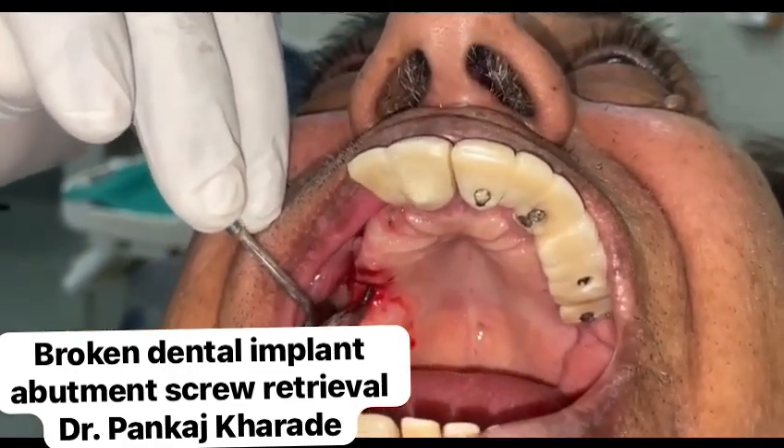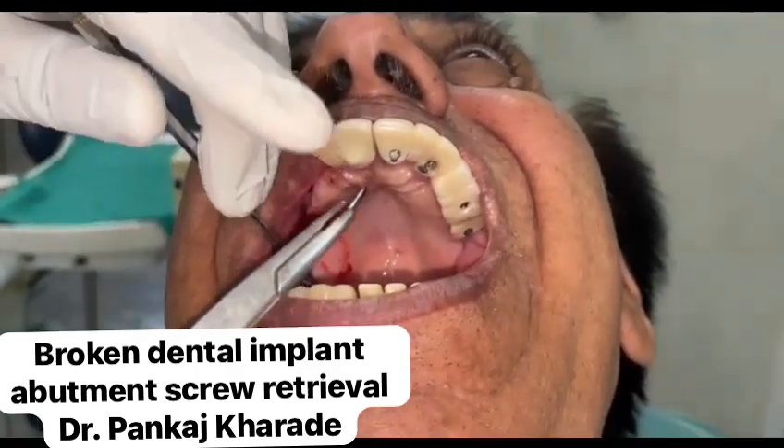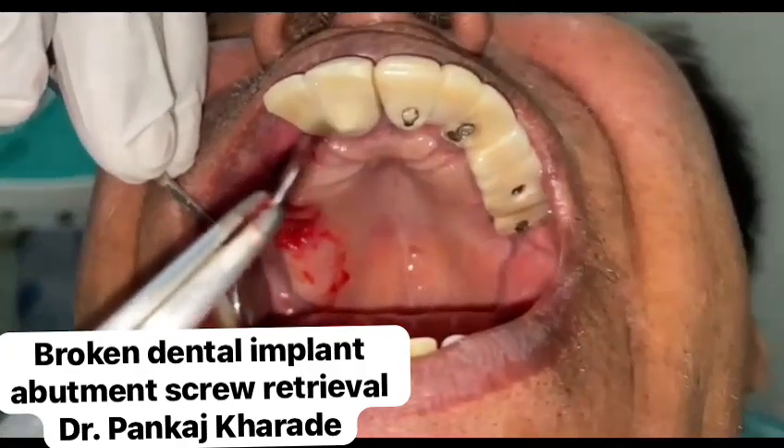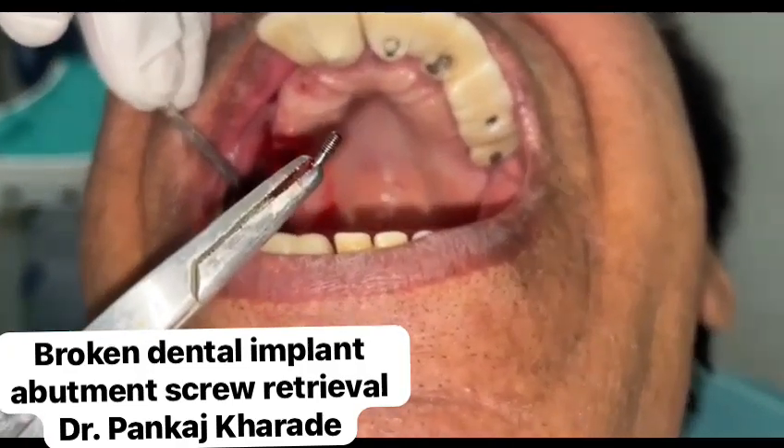Also, a high-speed handpiece equipped with a diamond bur can be used to prepare a 1mm slot across the most occlusal portion of the broken screw fragment.